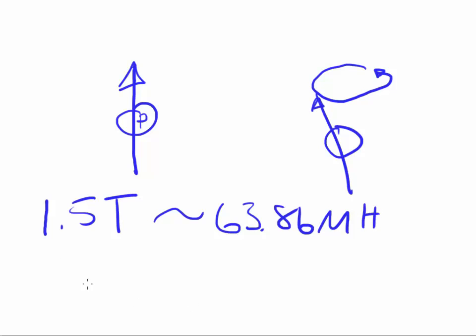So this is basically a common frequency in the radio band. So what do we use? We use an RF transmitter, RF standing for radio frequency. You'll see these transmitters around town, and this is what we use to receive over-the-air broadcasts.